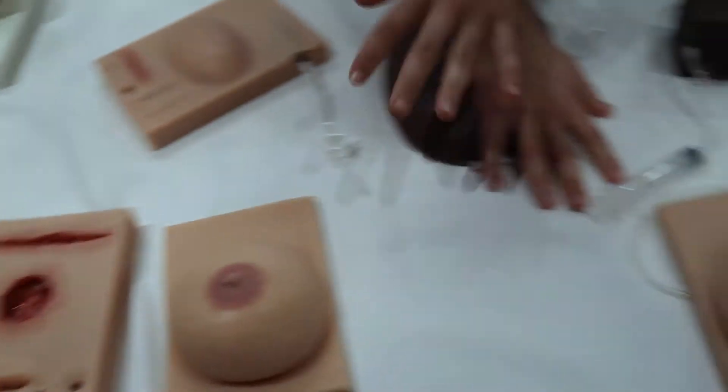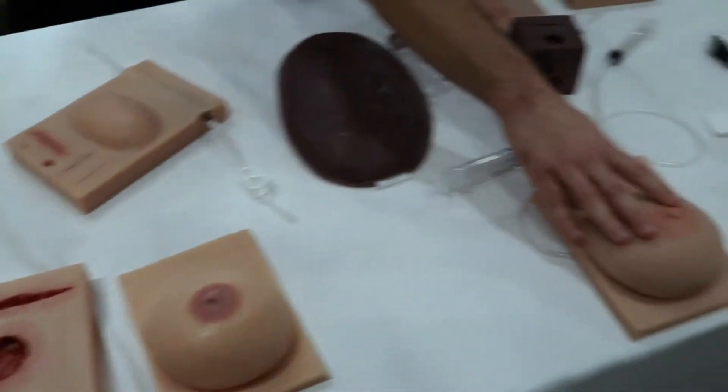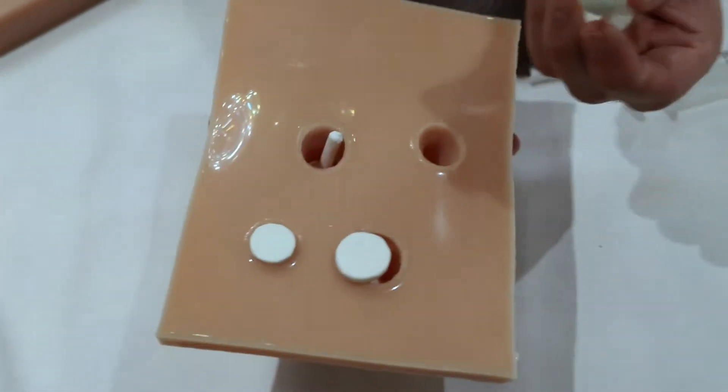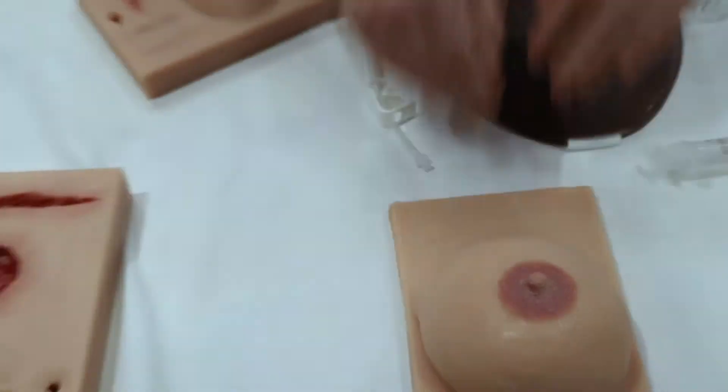We have breasts in different sizes, lactating ones with cracked nipples, inverted nipples — whatever you want, we got it. Here we have breasts with masses that you can provide different scenarios to your students so they can assess where the masses are.